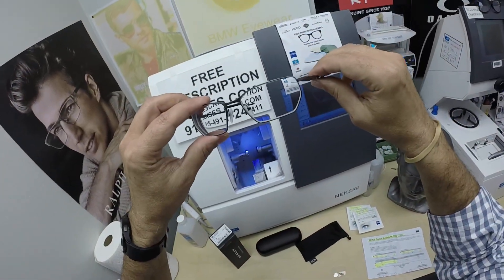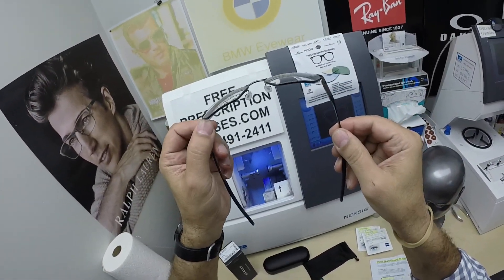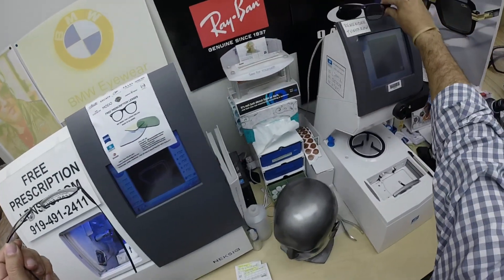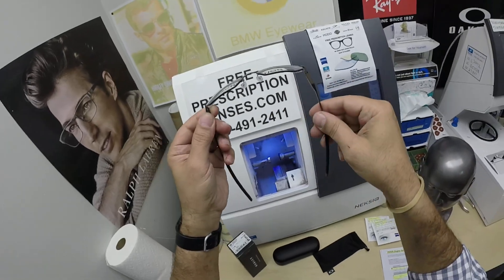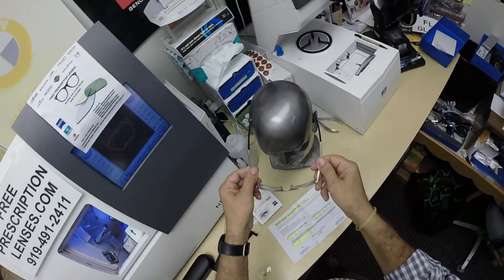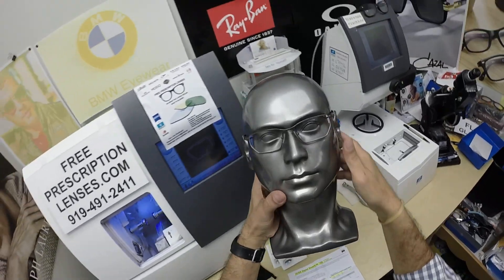Very angular, very unique — this is a six-base frame. Most frames are four-base, meaning it's close to 90 degrees. You can see the built-in wrap and curvature the frame has, so it hugs the face very well.